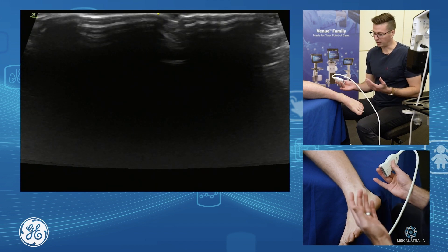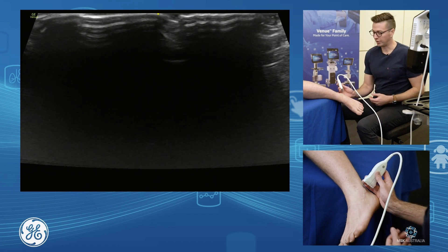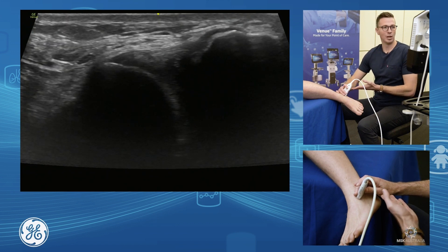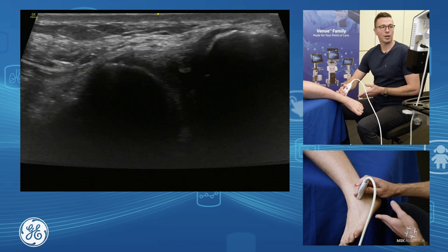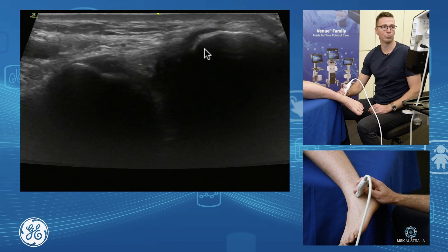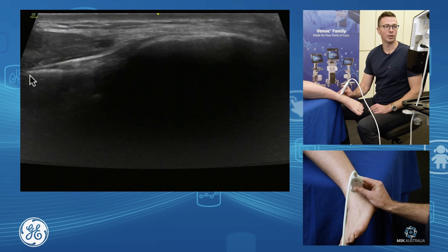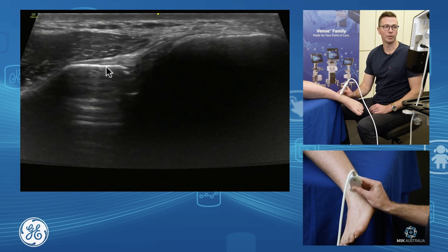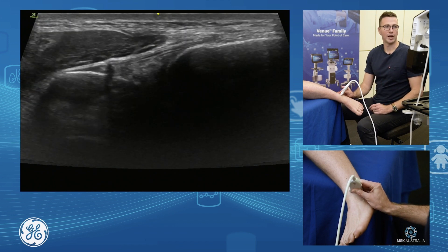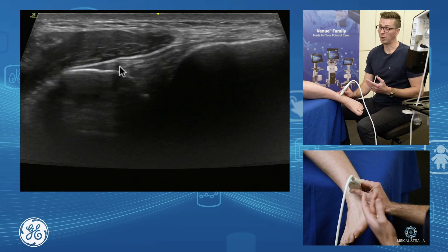The other ligament we want to assess - and it's a really important and easy one to assess - is our anterior inferior tibiofibular ligament. We're going to go from our ATFL assessment position, parallel with the sole of the foot, and rotate our probe around. We keep the fibular end anchored and rotate the tail end up until we get onto the tibia. This brings us down to our AITFL, our anterior inferior tibiofibular ligament. That's one way to go about it.